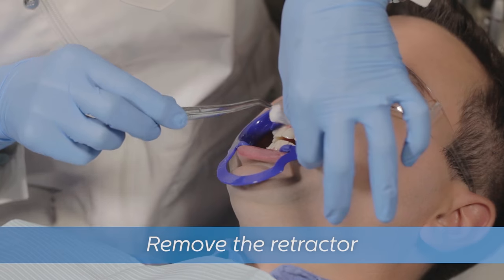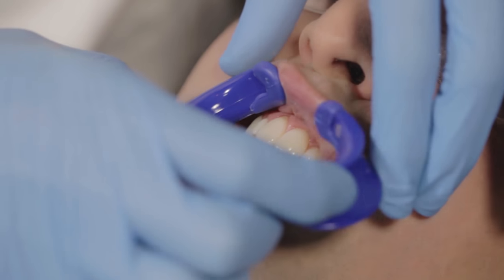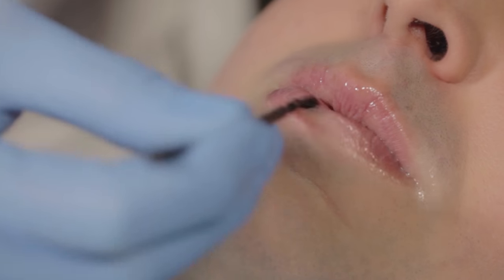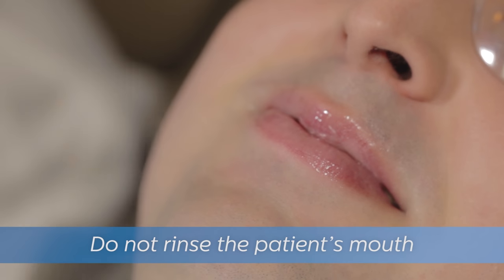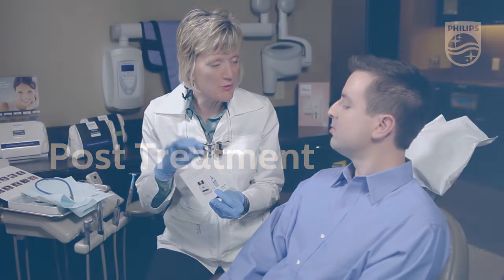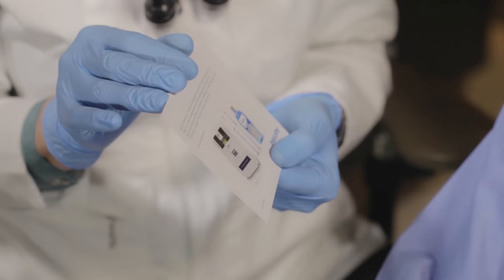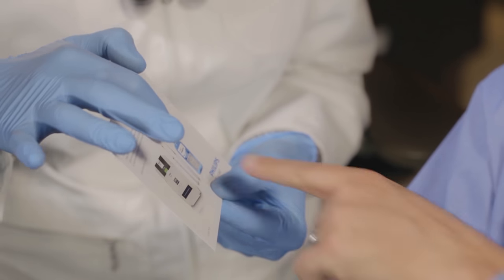Gently remove the cotton rolls and retractor, and apply another layer of vitamin E oil to the patient's lips. Do not rinse the patient's mouth. The procedure is now complete. Give the patient the provided post-care instructions and make sure they know they should wait 30 minutes before removing the varnish.